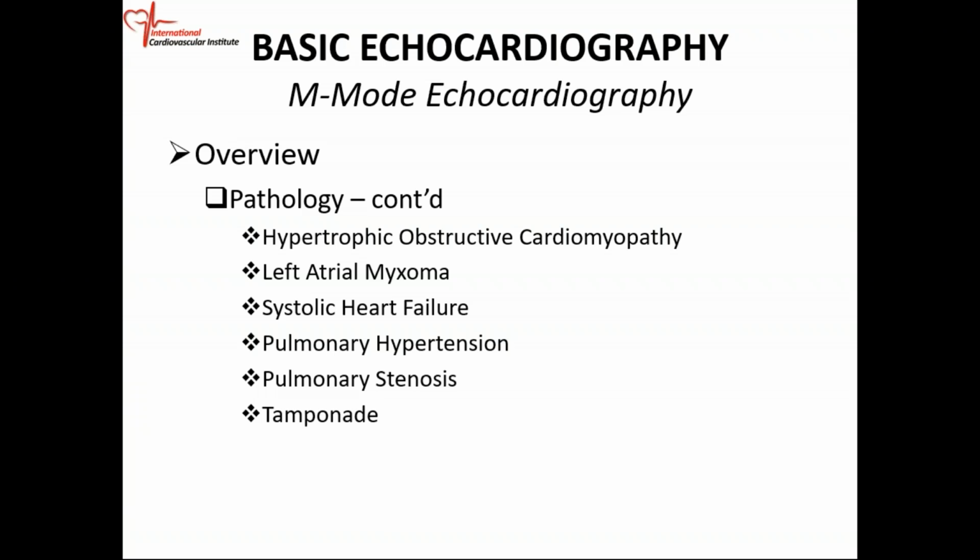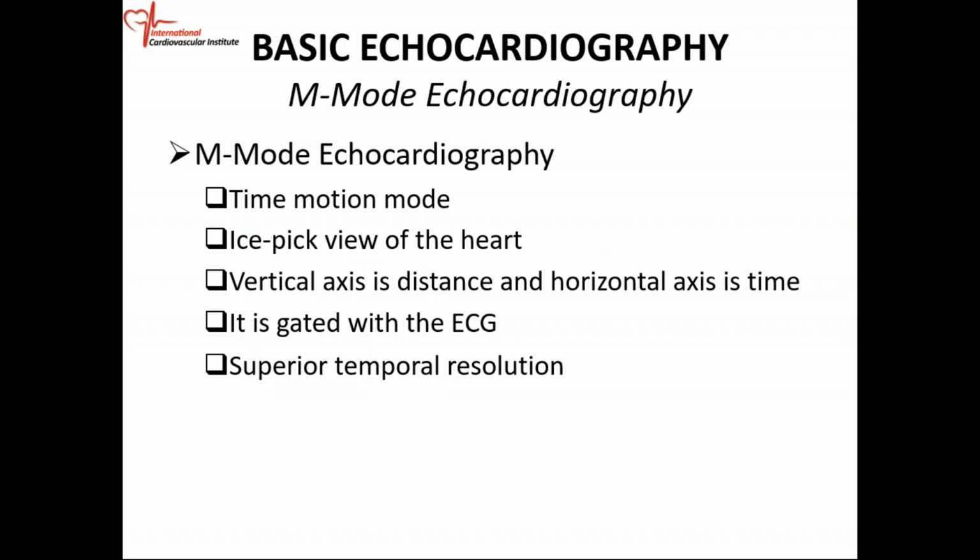So the thing about it is there are probably only 12 classic M mode features they can bring. So once you learn these M mode features, you're on your way. But you should try and go a little bit above and beyond so that you have a thorough understanding of M mode.